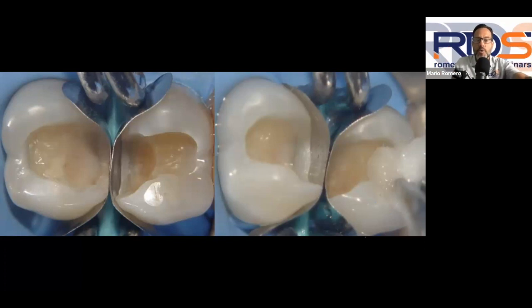Just because, as you are seeing in the photo, these are two rings, because the bite tines on each ring have different lengths, different heights. So there's one that is short, one that is high, so that you can literally superimpose one ring. You can put two rings, as you are seeing on this photo, for clinical situations like the one that I'm sharing with you here. And because these two rings have different heights, and I will share with you a diagram that was done by a friend of mine just to exemplify what this means, you're going to be able to put one right on top of the other.